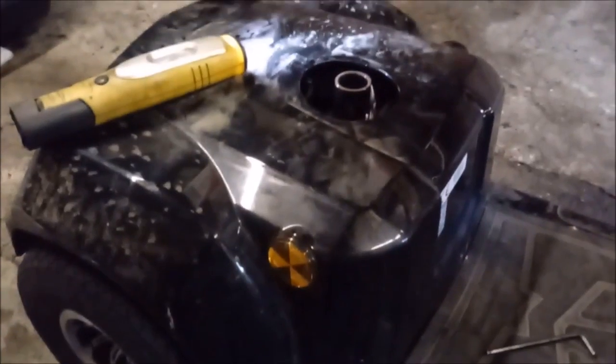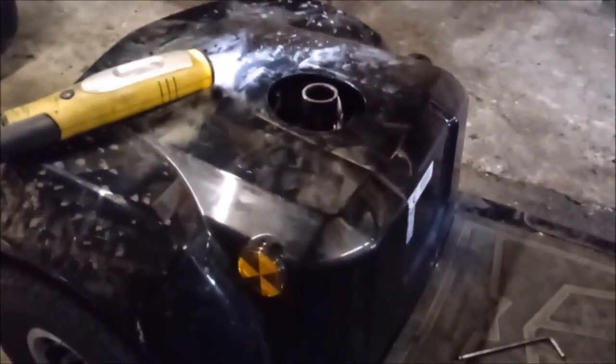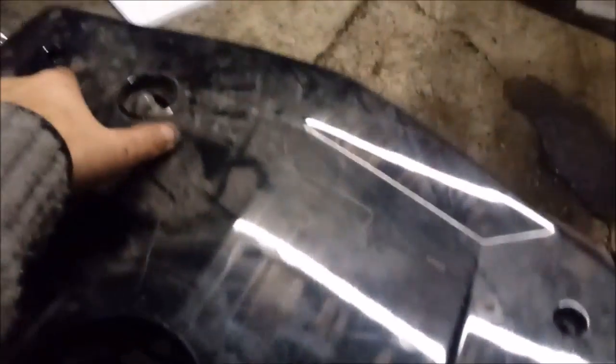Now to release the rear section of the cover and take that off. Right, now having removed 2 screws from down here, one there and one that side, one up there and one up there, this whole panel should just lift off, he says. Right, let's get the carpet out of the way. Once you get the carpet untucked from the front lip that holds it down a bit, then the whole thing just tilts to the back. We'll put that there, like that. And there we have the batteries.